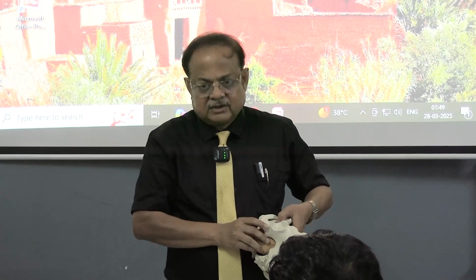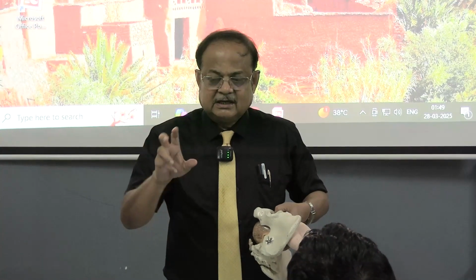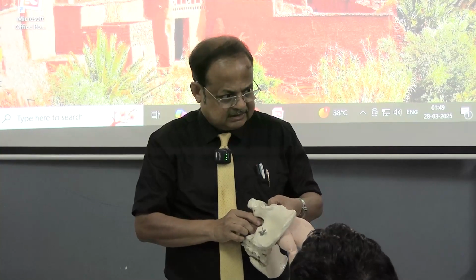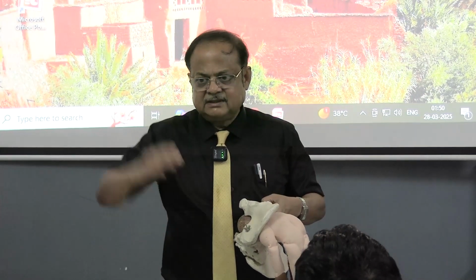The rotation should be complete, or at least you know what the position of the head is and what the station of the head is, and the approximate weight of the baby, if there is a macrosomic baby. The bladder should be empty, and the membrane should be ruptured before application.